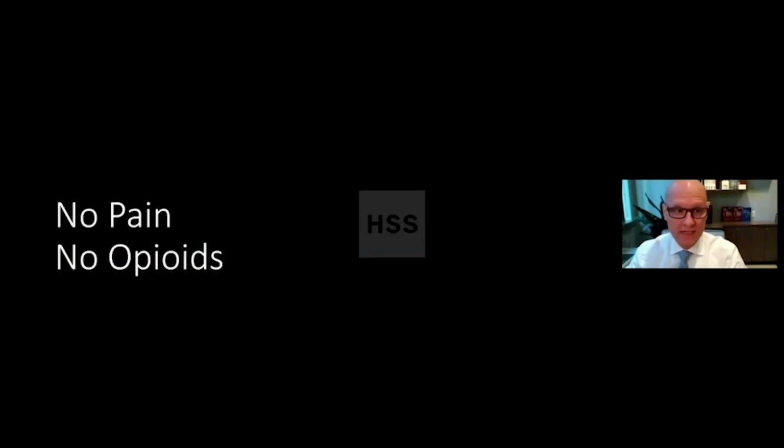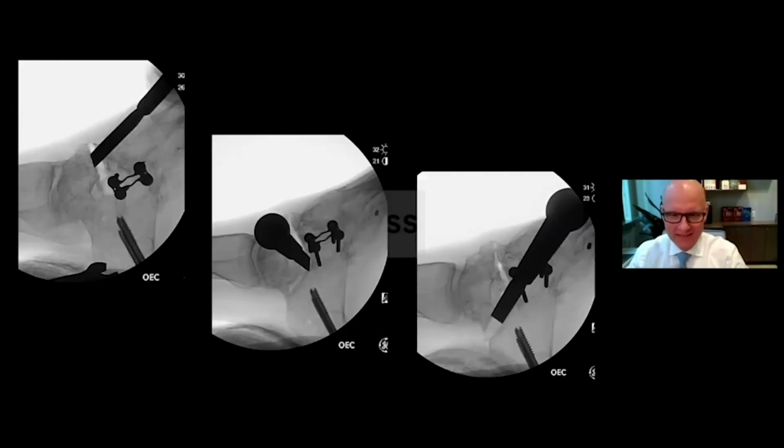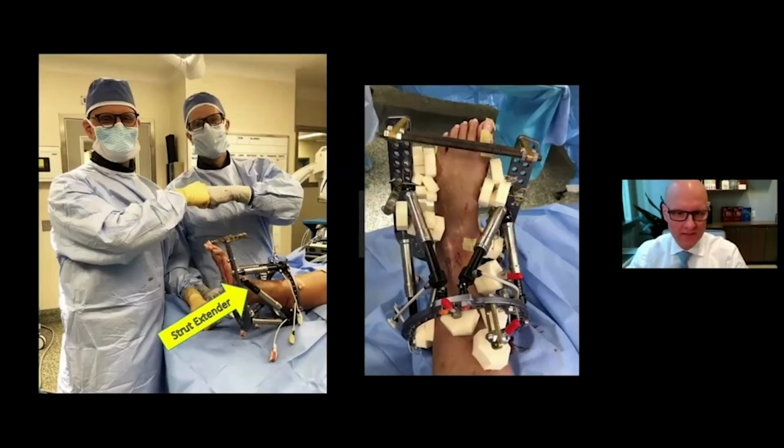Again, this guy had no pain and no opioids. He did get a pin infection. I was hoping maybe we won't even see pin infections because it's so gradual, the skin is happy, but he did get a pin infection. U osteotomy. So I've used this for U osteotomy. I've ended up using it around the foot a fair amount, as you can see. And same idea, like this can be pretty uncomfortable doing the distraction through a U osteotomy.